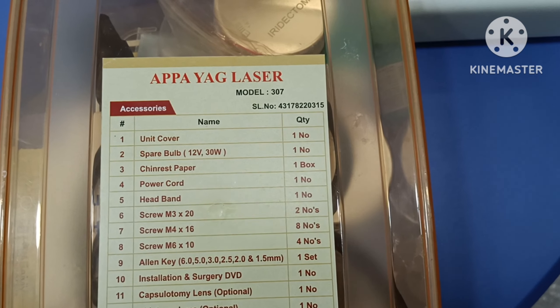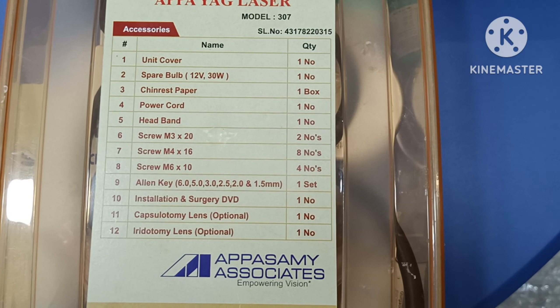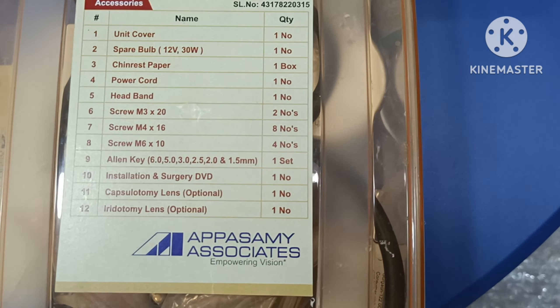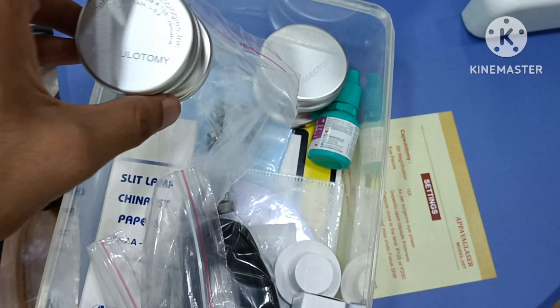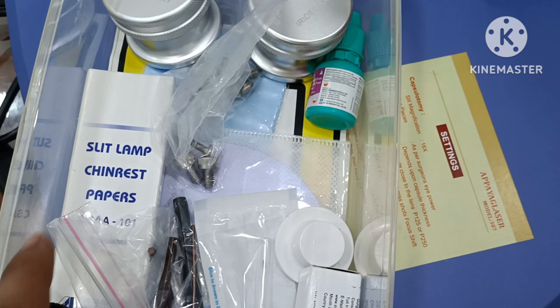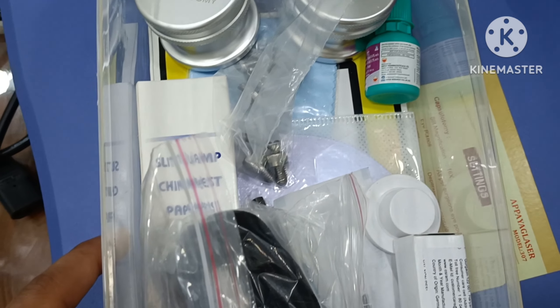Unit cover, spare bulb, chin rest paper, power cord, headband, screw, LN key, installation and surgery DVD, capsulotomy lens, and iridotomy lens. All accessories available.